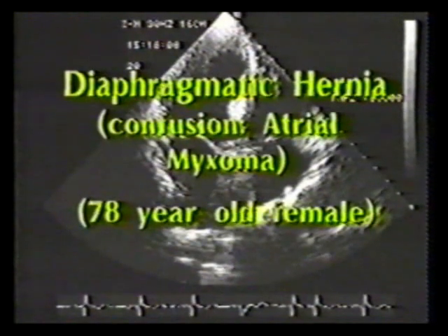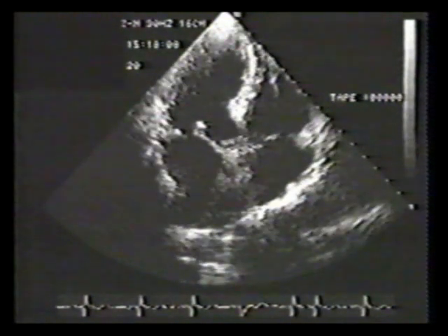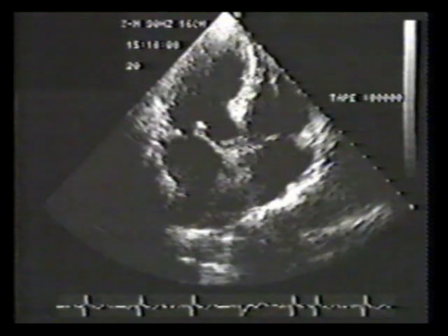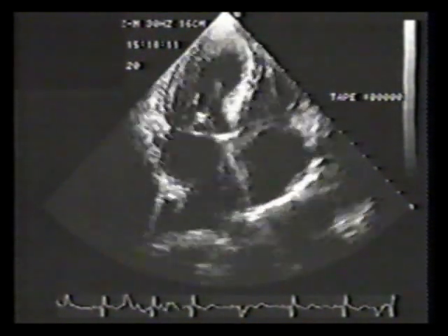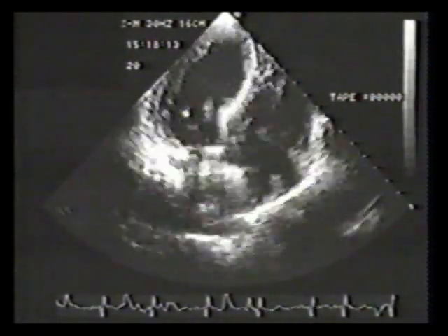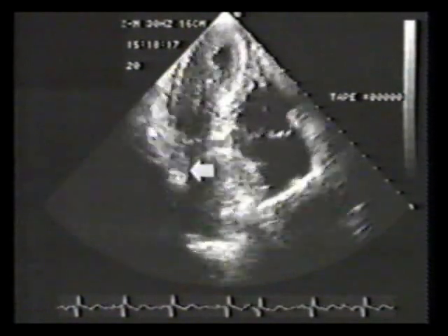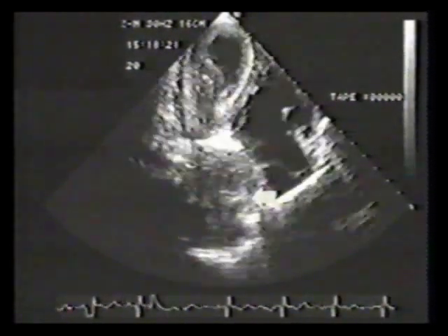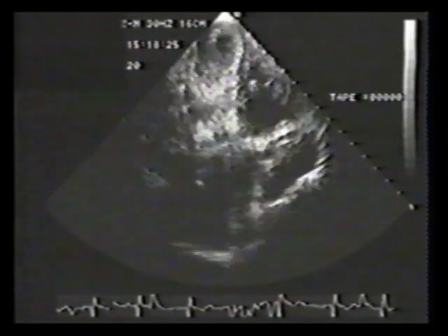A common masquerader of cardiac mass is a diaphragmatic hernia. This is an elderly patient with a large diaphragmatic hernia prolapsing beneath the left atrial cavity. This is with the apex up. Notice that in the left atrium, an ovoid mass appears. Also, periodically, you'll notice air within this mass as the patient swallows some carbonated beverage.